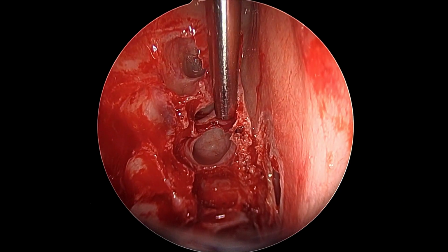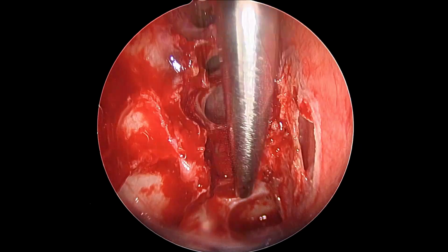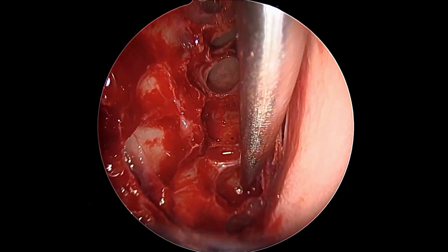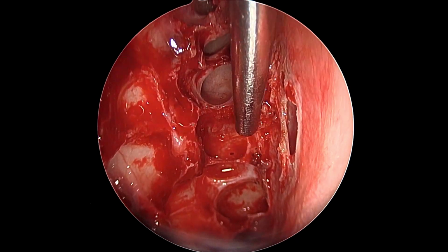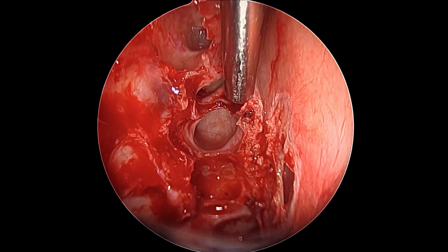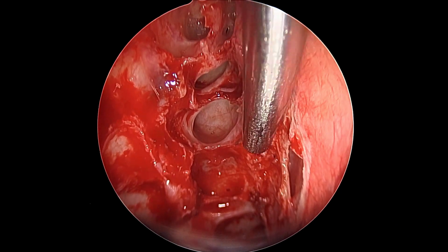Here we can see with the 70-degree endoscope pointing upwards the entire skull base from the frontal to the sphenoid, and this is the sphenoid. We come to the posterior ethmoidal cavity, the anterior ethmoids, and the frontal recess looking upwards.